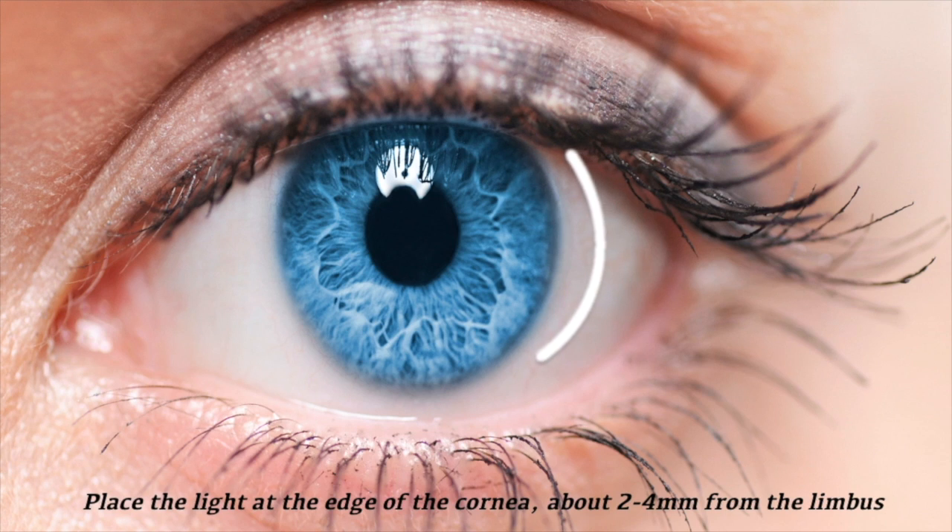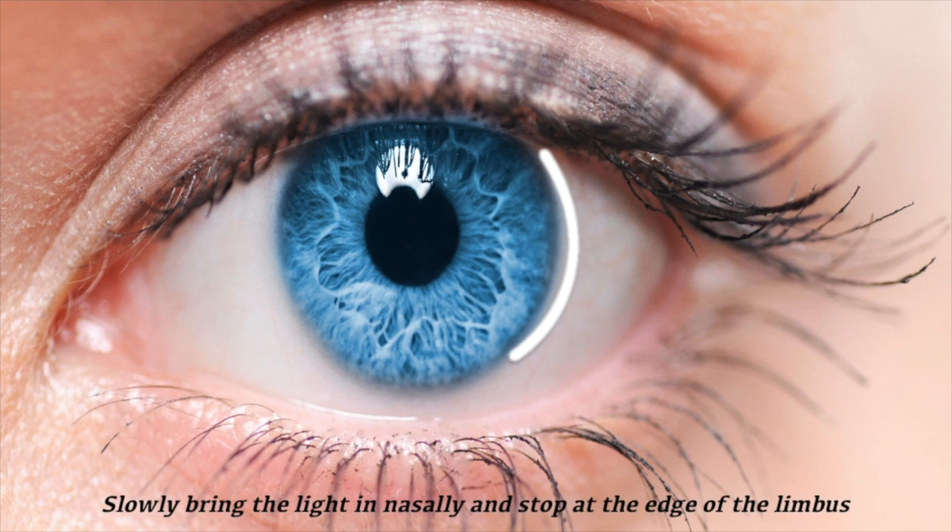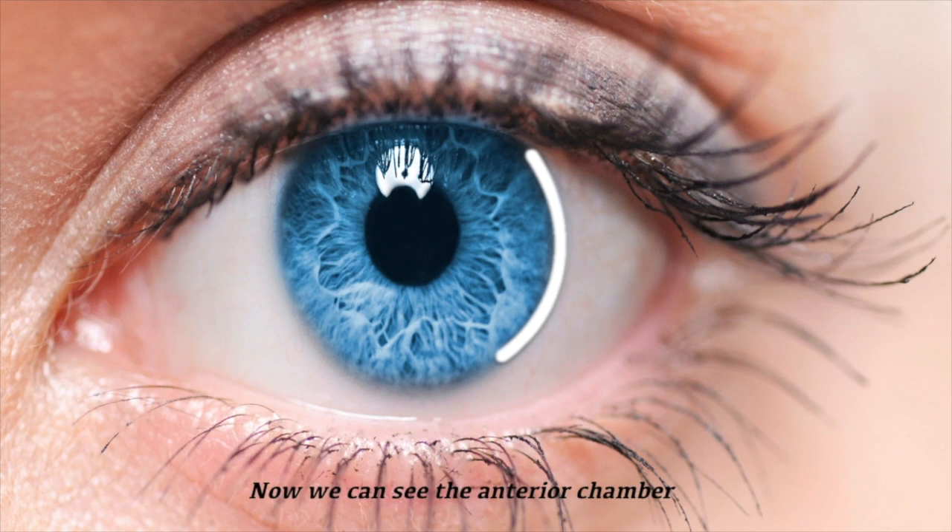To perform the test, we bring the light in from the temporal side and place it at the edge of the cornea about two to four millimeters from the limbus. From this point, we slowly bring the beam in nasally and stop at the beginning of the limbus. This is when we first see the anterior chamber. The image we can see has two beams of light — one from the cornea and the other from the iris — separated by a space, which indicates the depth of the chamber.